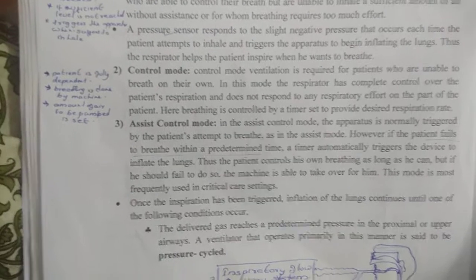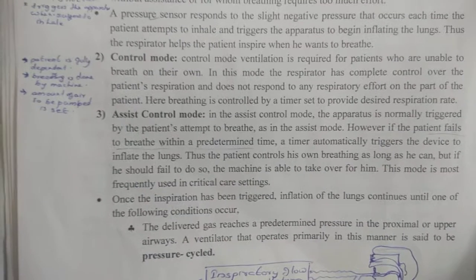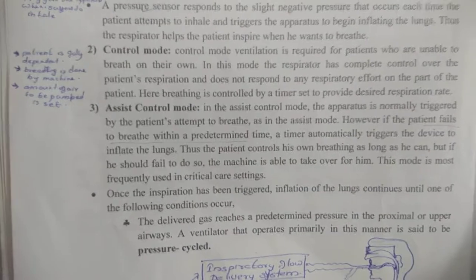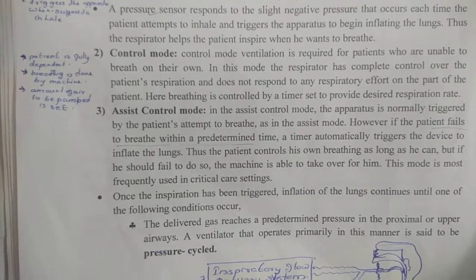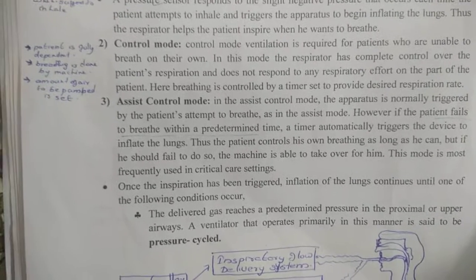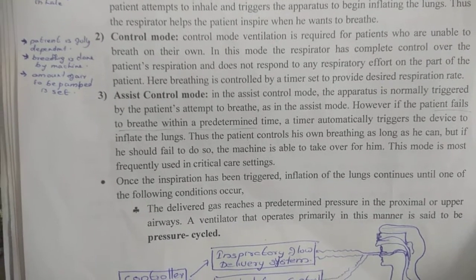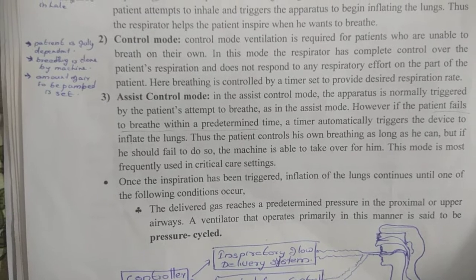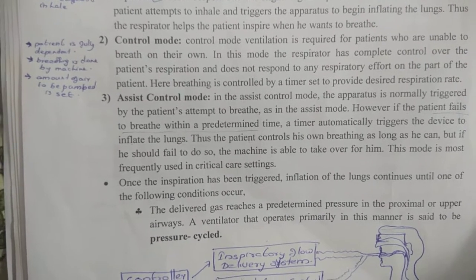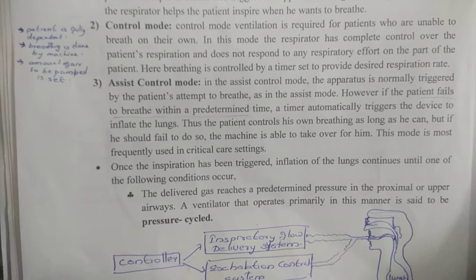and when the patient is not able to respirate by himself or herself, then the timer automatically triggers the device and it starts functioning. That process continues until the patient recovers to the normal stage. Until that stage, the control mode is continued. So this is the assist control mode. Both the assist mode and the control mode are used here.